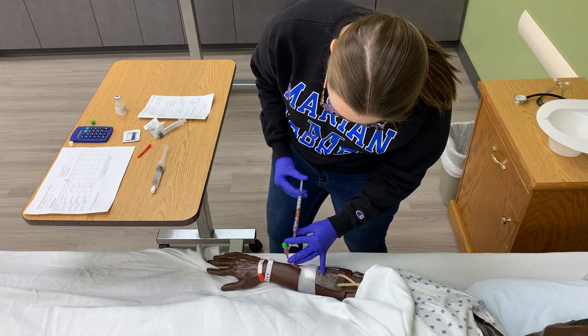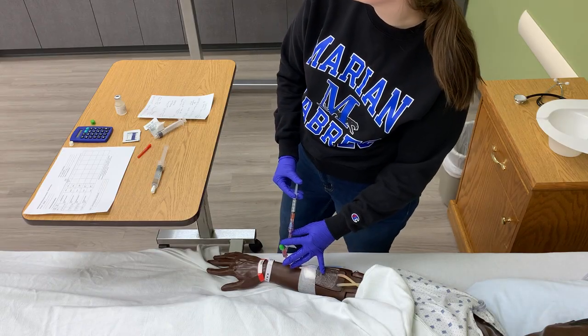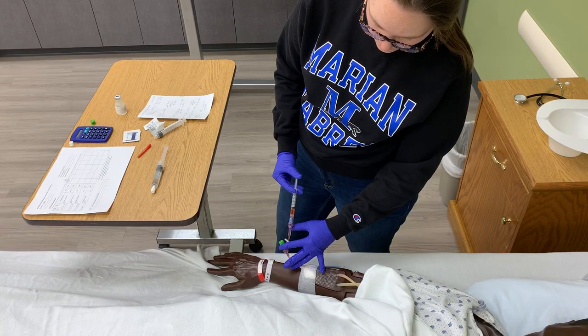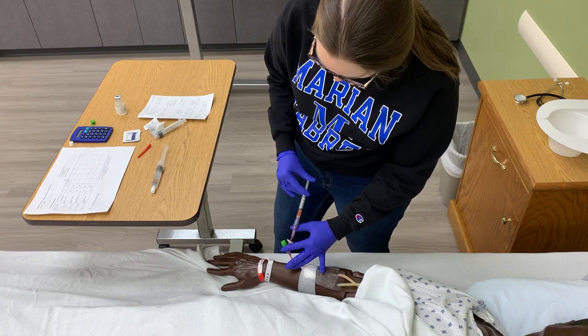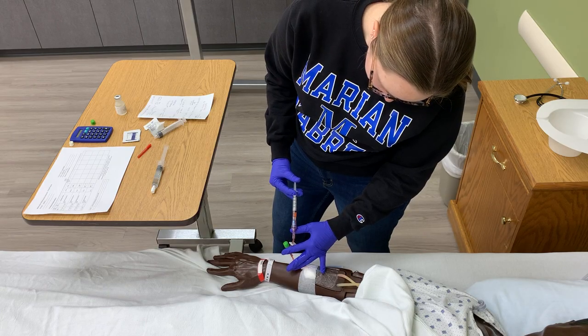Okay, pushing another 0.3. Pushing another 0.3.